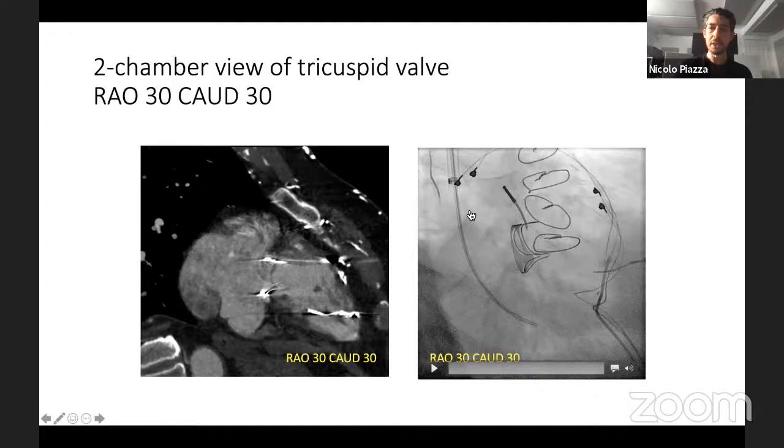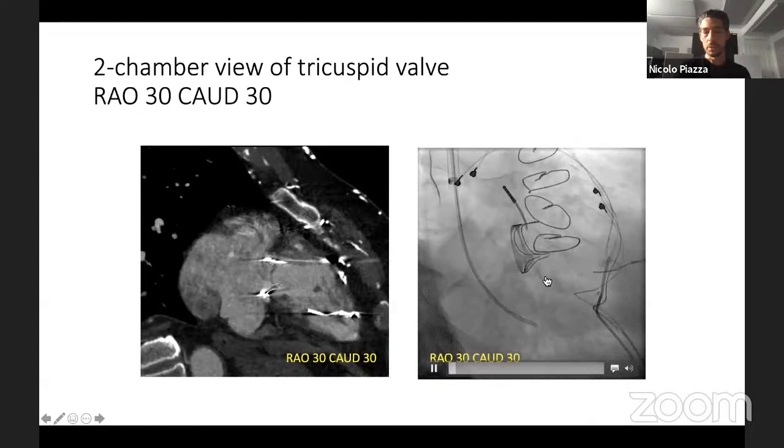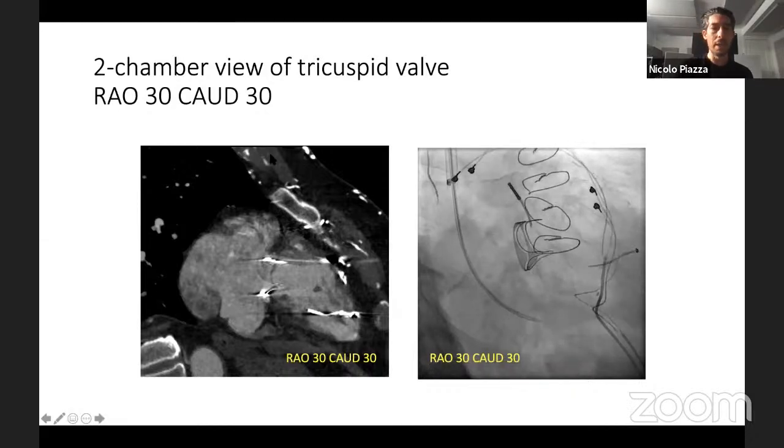And we were trying to float, or at least get access into the right ventricle and pulmonary artery, because we were going to perform a valve-in-valve within this failed tricuspid surgical prosthesis. The problem was that we kept on going into this area and space that, at least initially, was a little bit boggling, and we didn't understand why.